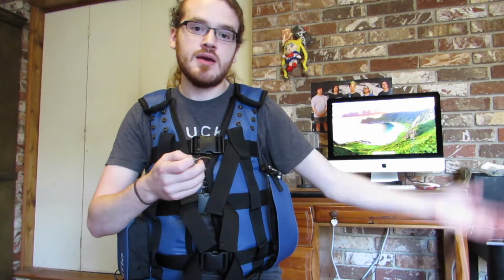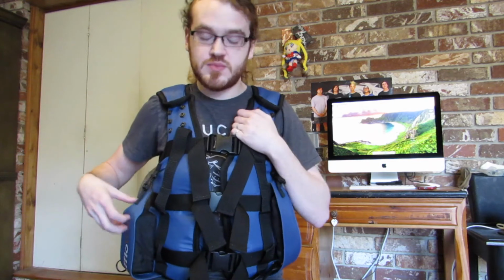Now, the battery is actually a little bit weird, because when I first got this vest, I was able to get probably about 4 treatments per battery charge. And that is with letting the battery charge a full 8 to 12 hours in between use. So, say for example, I wake up at about 7 in the morning. I would let the battery charge overnight, take a treatment at 7, and then at night, I'd take another treatment around 7. I could do that for 2 full days before this battery was completely depleted, and I would have to let it charge for a full 12 hours overnight before I could use it again.